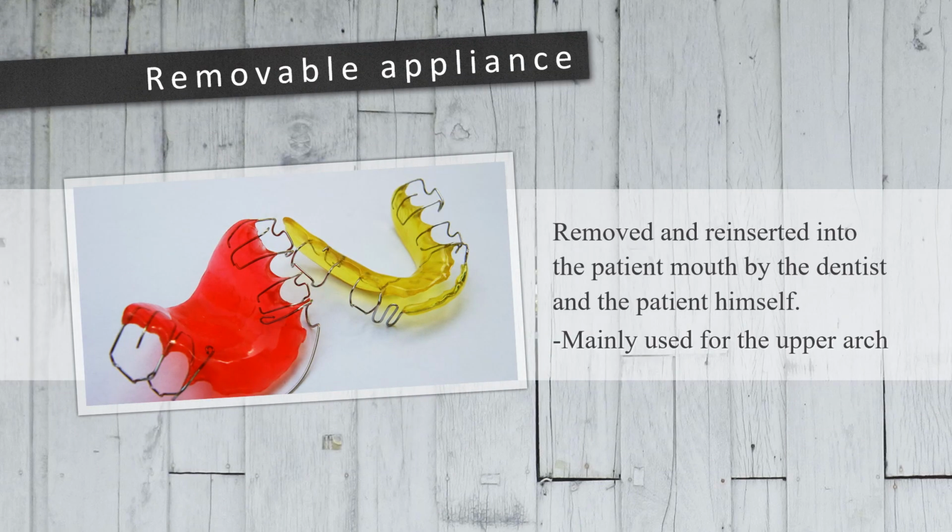The removable appliances are removed and reinserted by the patient, so they are called removable, and they can also be removed and adjusted by the dentist or orthodontist and inserted intraorally. They are mainly used in the upper arch and could also be used in the lower arch.